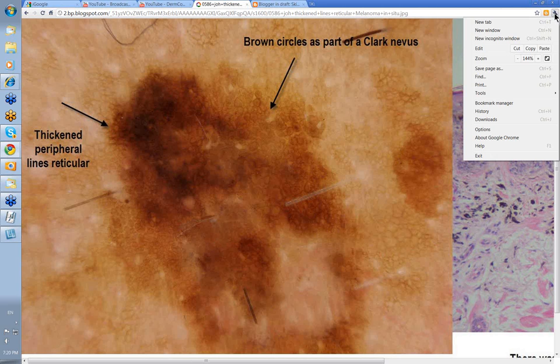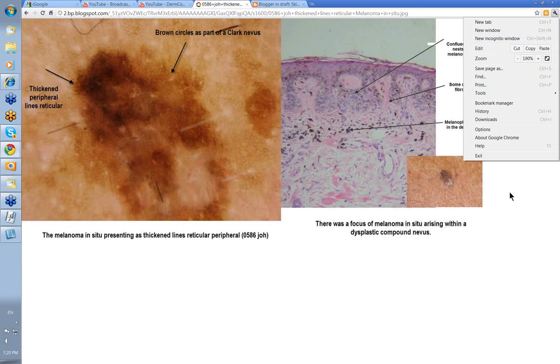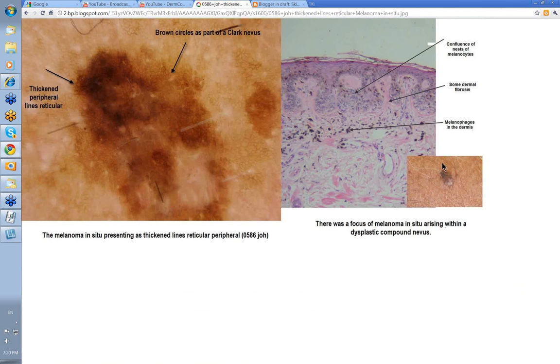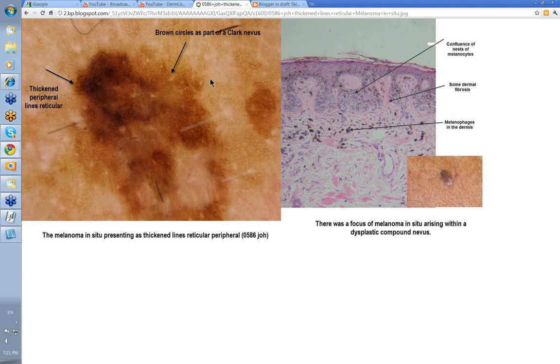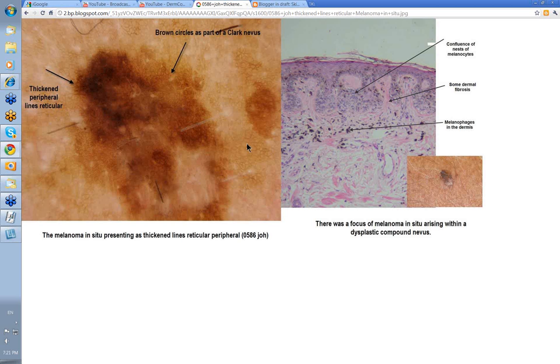Here's another example with some histology. This was a clinical lesion on someone's back. This bit almost looked like a SEBK but you had this pigmented area. When you had a look at the pigmented area, you've got this thickened area of darker lines reticular peripheral, and varying sizes of lines reticular within this lesion. There are actually brown circles here, and these brown circles were part of a Clark nevus that this was reported as arising in. The histology showed a confluence of nests, part of the features of a Clark nevus, melanophages in the dermis, and areas of a focus of melanoma in situ arising within this.